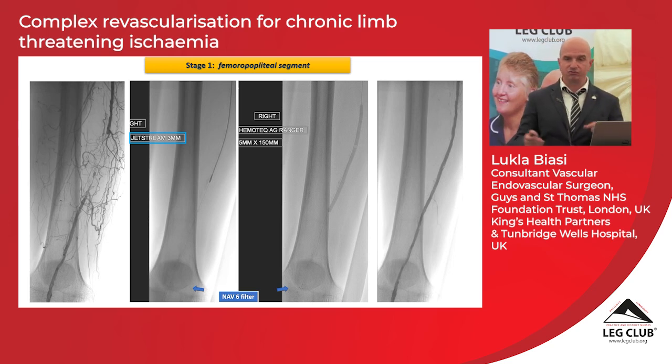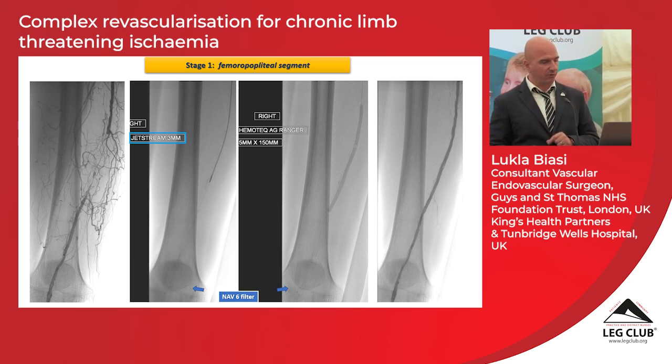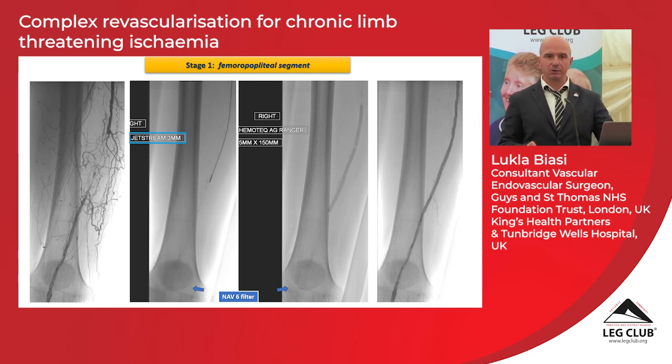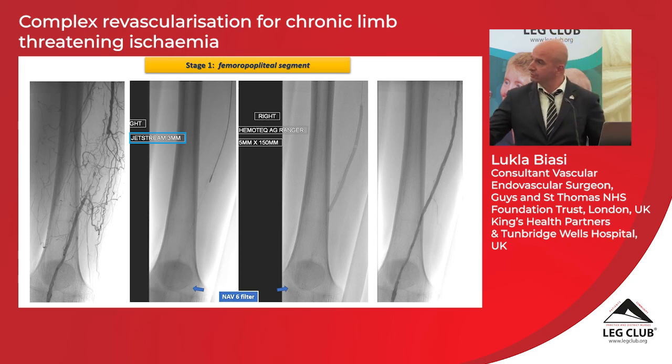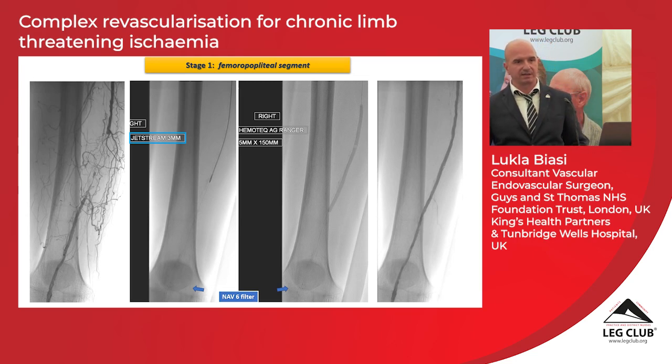So that was drilled through with the atherectomy, with the drilling device and the filter, and then ballooned with a drug-eluting balloon, restoring a very good circulation here. But below the knee, the arteries that are very compromised were extremely calcified and extremely small. So although there are drilling devices for the tibial arteries, that would have been an extremely risky undertaking.